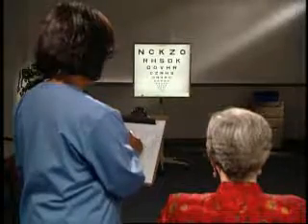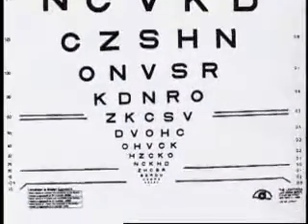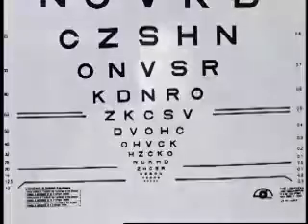If the subject becomes disoriented or the examination is interrupted, examiners should use the two parallel lines, the single straight lines, or bent lines to reorient patients to the last line they read. We need to keep in mind that the different charts have different roles. Charts R, 1, and 2 all serve a different purpose.